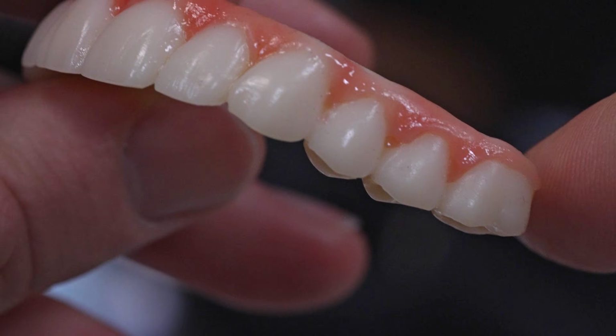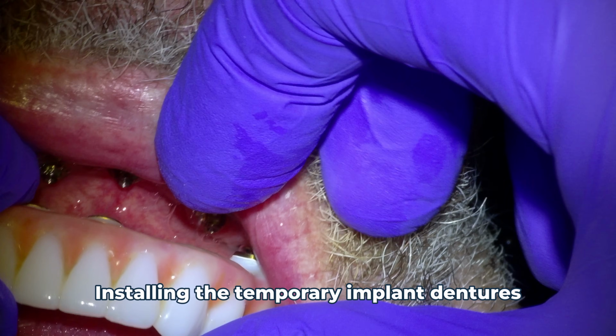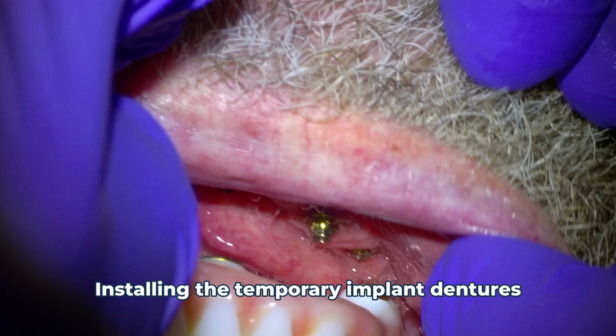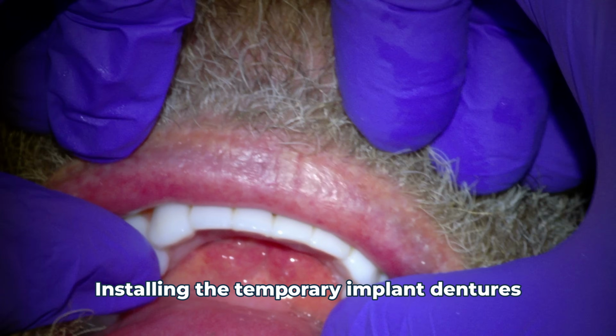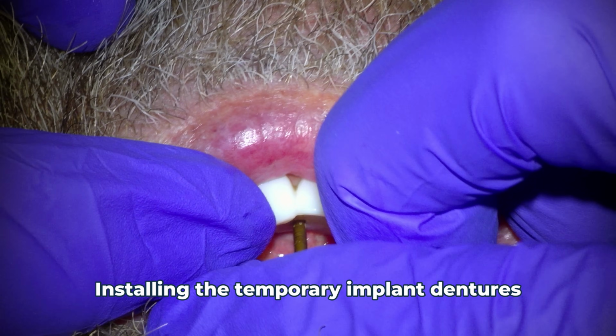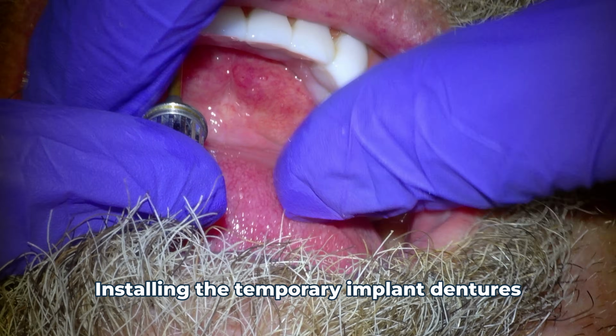Now you can see that you are getting teeth in a day, as they call them, but it's a long day. I mean, if you're doing both arches of the mouth, this can take 8 to 12 hours. The surgery is only a few of those hours. Most of that time is actually the lab technician and or the dentist designing the temporary dentures.